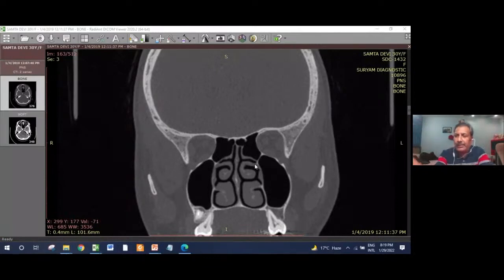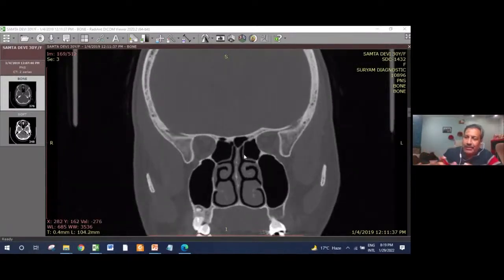Behind the postethmoid is supposed to be the sphenoid sinus, and it is not in a linear fashion that you are supposed to see the sphenoid sinus behind the postethmoid sinus. The sphenoid sinus is a more centrally located structure as compared to the laterally located bilateral ethmoids, and overall it depends upon the pneumatization of that particular patient. Now, to safely approach the sphenoid sinus, we always mention in our live surgical demos, always approach the sphenoid sinus medially. See this, along the nasal septum.